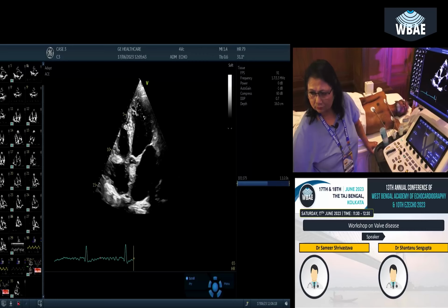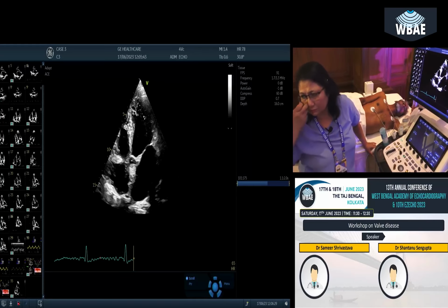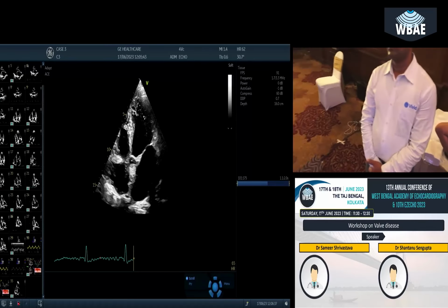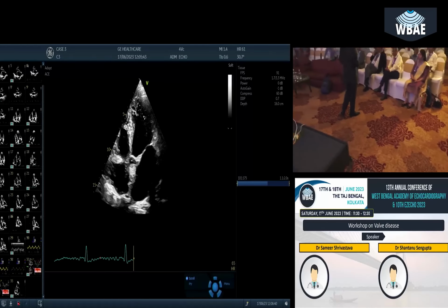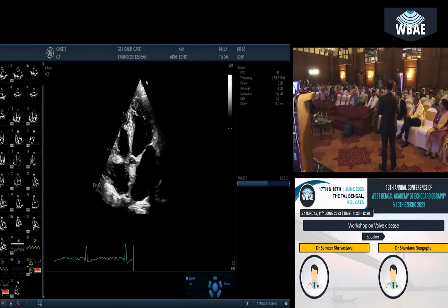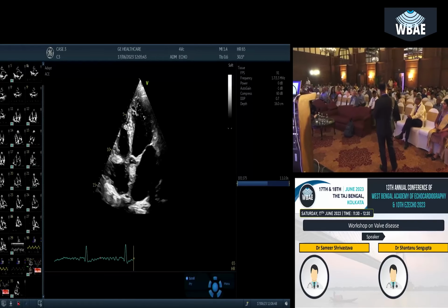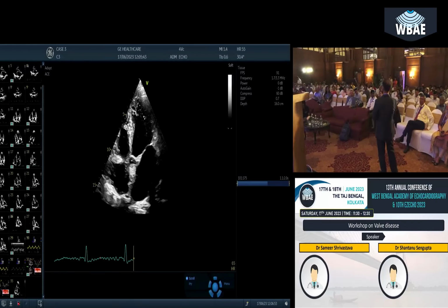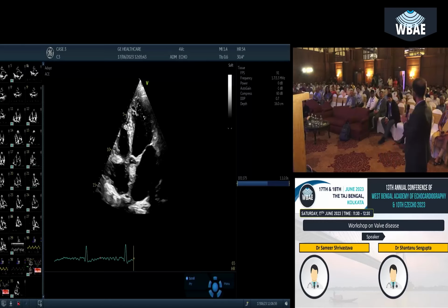What do I do? In early stage of RV dysfunction, the TAPSE will be compensating. Why? TAPSE is longitudinal motion. Anything more you can think of? Do you encounter this kind of problem? What do you do with that? I can answer, I'm just asking. Whenever there is an increase in RV volume, TAPSE will increase despite RV dysfunction. So you need to understand the dichotomy between the two. It is earlier RV dysfunction.